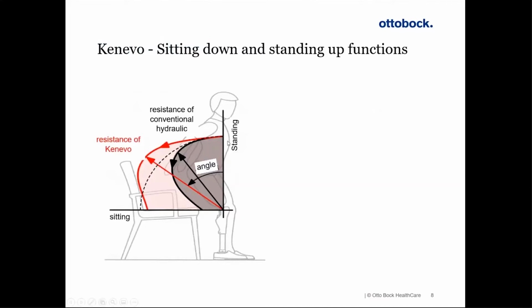When a patient stands in front of a chair and wants to sit down with the weight loaded on both legs, the prosthetic and the sound limb, then the hydraulic produces high resistance first, but once the flexion progresses, the resistance of the hydraulic usually diminishes, and the patient needs to balance the body on the sound limb to sit down on the surface of the chair in a smooth manner. That is something that K2 patients usually can't do, or they struggle with it.